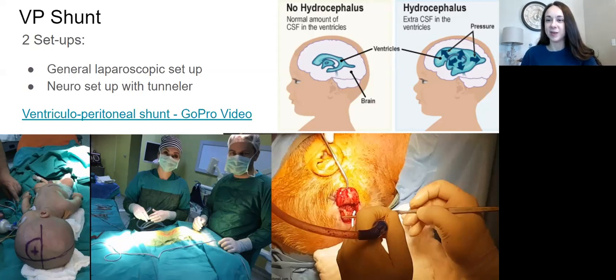If you have to do that, I suggest two Mayo stands. I put two setups, but really it's one back table setup, and then I gave general surgery a Mayo. Here's your Mayo. I put a certain amount of counted supplies on there for a reason. The only time I really had to go back over there was to hand them suture. Otherwise, it was self-service off the Mayo, which is always terrifying because surgeons make a mess, but it had to be done. Then I could stay with neuro, make sure we get this VP shunt in correctly.